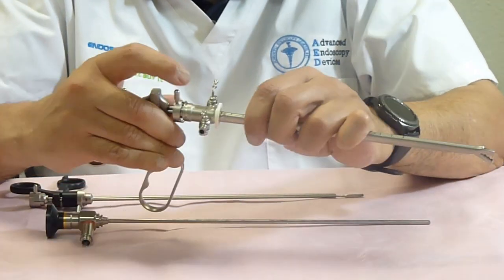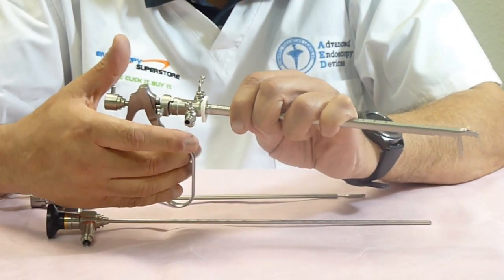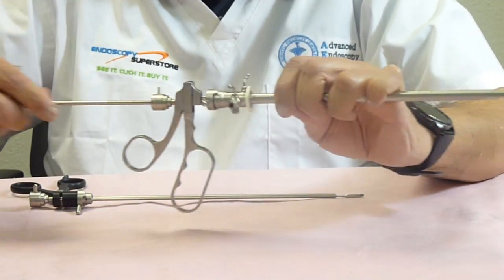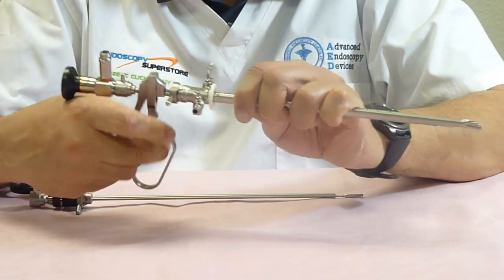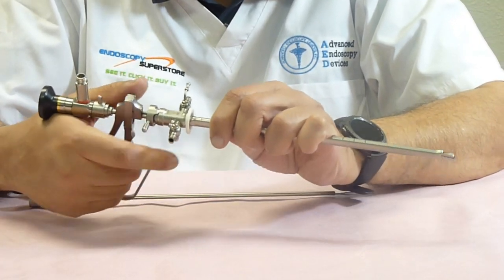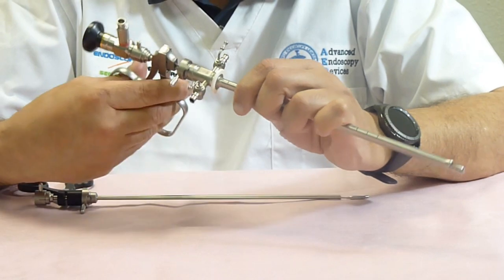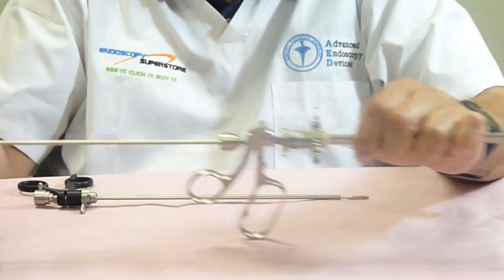For patients who have bladder stones, we have our lithotrite, which is our manual stone-crushing forcep. You can go in there, put the scope in to view, and break up the stones inside the bladder — all under visual control with our stone-crushing forcep.